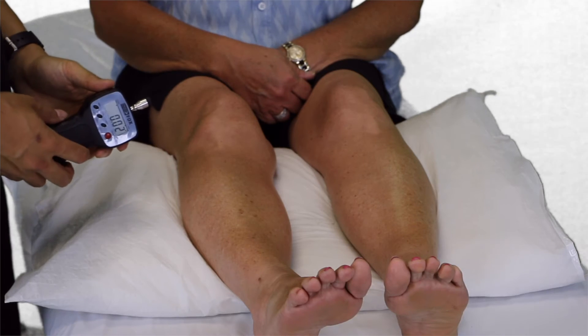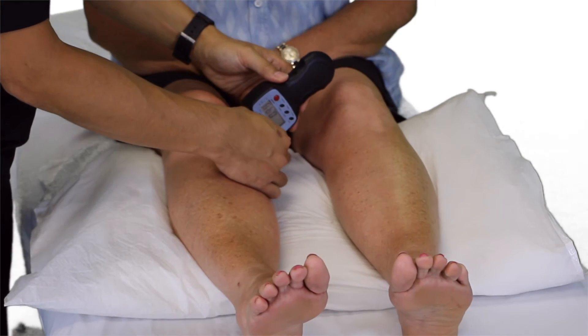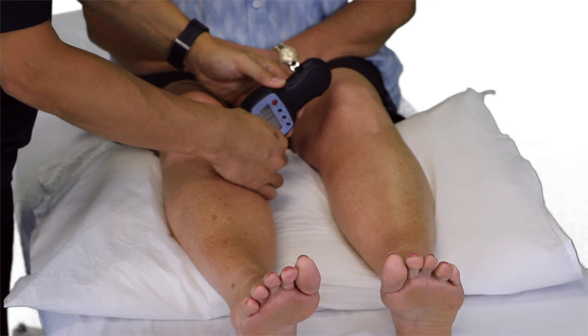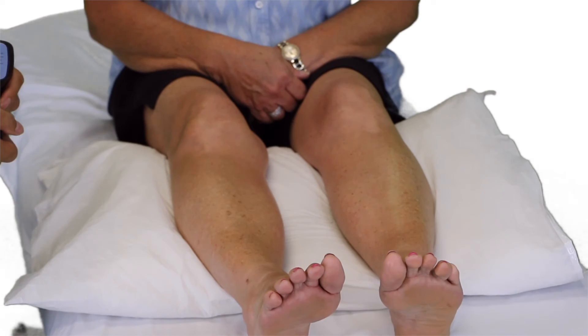These findings should be compared to the uninvolved side, as you see here. Three repetitions are used and averaged.